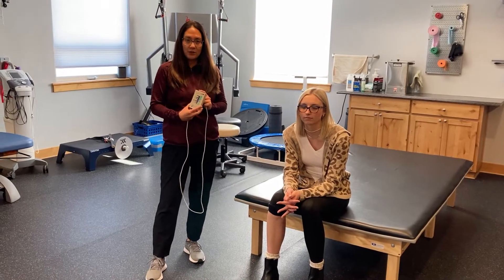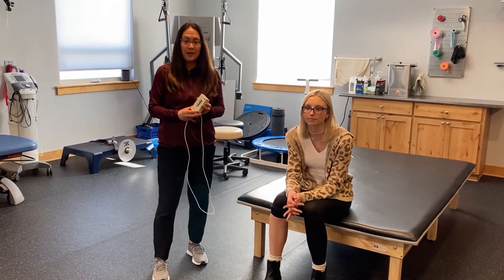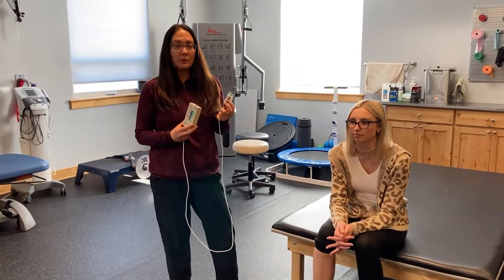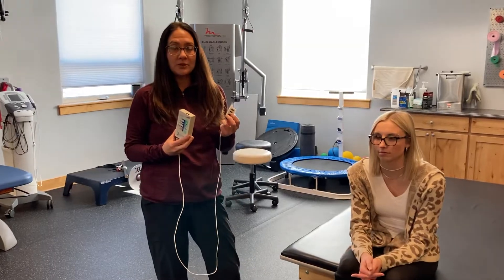This is a device that we use in our office. What the biofeedback does is it uses a little gel electrode or a sticky patch to calculate a muscle's energy output.